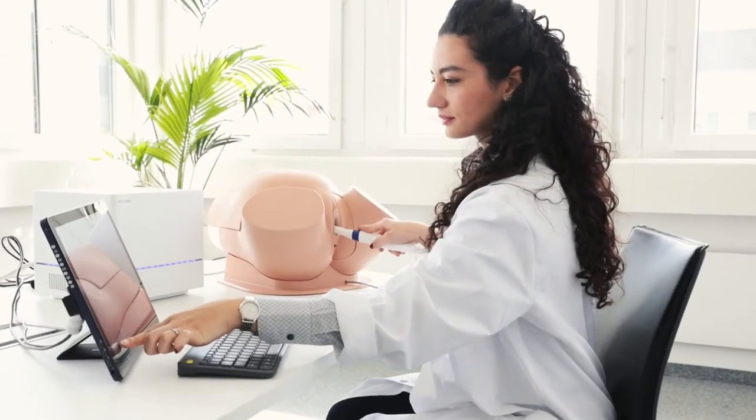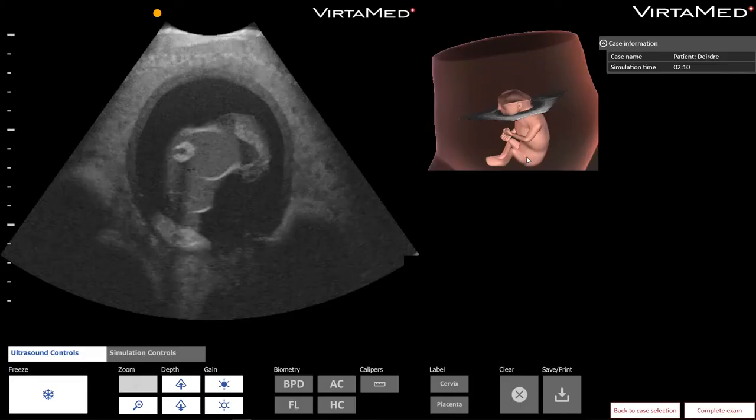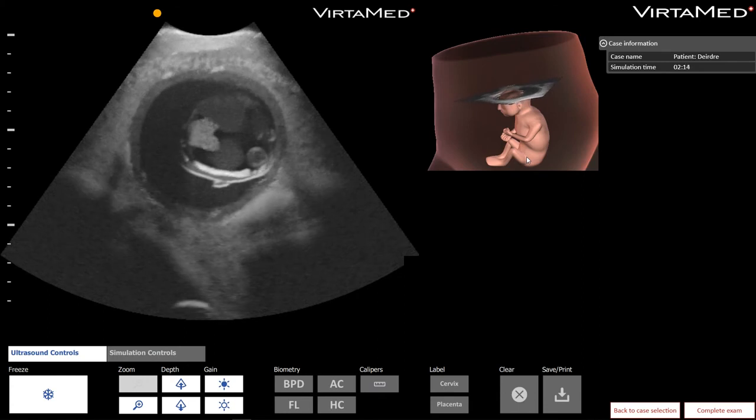I mean, you have two things going on. One is you're in the middle of an ultrasound and you find an abnormality, and the second thing is you have a patient laying there who has to learn this material and has to learn that she has a baby with an abnormality. And so you have to be able to do the ultrasound and identify the abnormalities, and then somehow provide this to the patient in the best possible way.